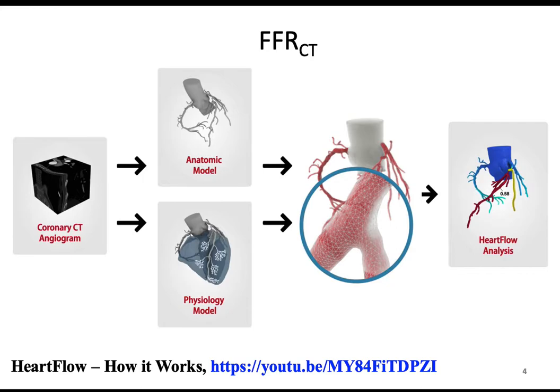But it's thought of as the gold standard because that's what the interventional cardiologist uses to decide whether to stent or not. And so if the goal is every time you send somebody to a cath lab, they should get stented, given that it's a location that can be stented and there's no operative snafus, it's a waste basically to send someone to a cath lab, make this measurement, and have it be normal. Like that's a waste of resources. That person should have been told earlier, yeah, you have a speck of something there, we'll watch it, but right now we're not going to put a stent in based on the guidelines. And so that is kind of the overarching idea.